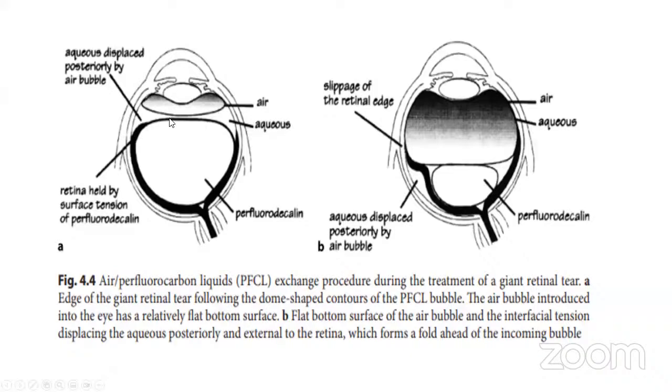When the air bubble enters the eye, it forms a relatively flat bottom face, as compared to the heavy liquid, whose interface surface tension is more convex.